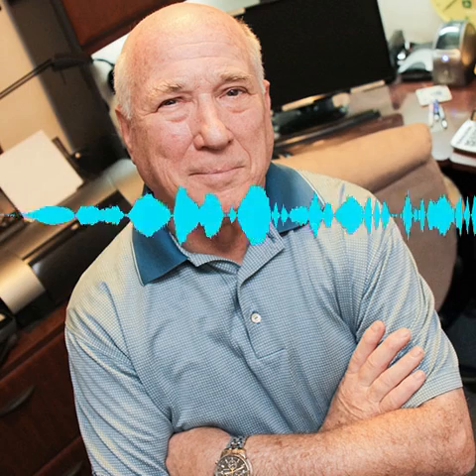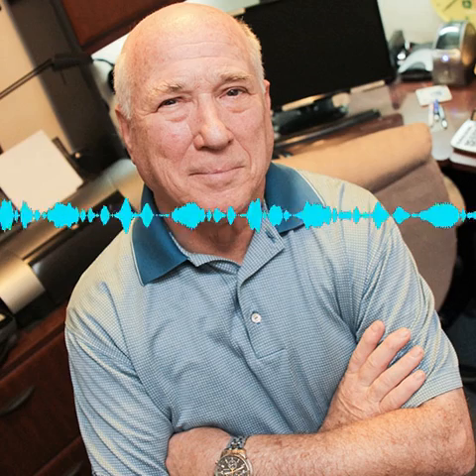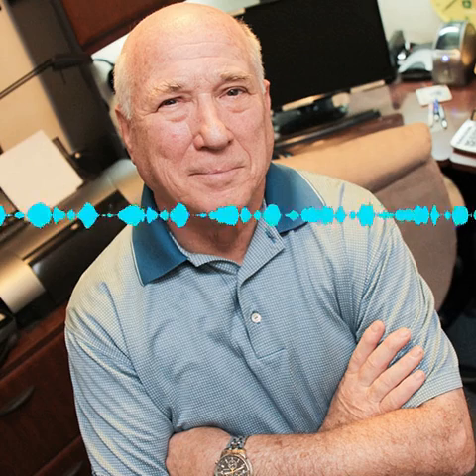With my little engineering mind at work, I have to ask: if I have sensors on my right and left wrists, and I'm walking along and there are obstructions on both sides, but I'm 5 feet away from the one on the right side and 12 feet away from the one on the left side, are the vibrations that I get different? Will I know that I'm closer on this side than the other? You will definitely know that. And you can tell very precisely just how far you are away from anything. I can tell you I'm exactly 16 inches away from this, with just a little bit of practice.